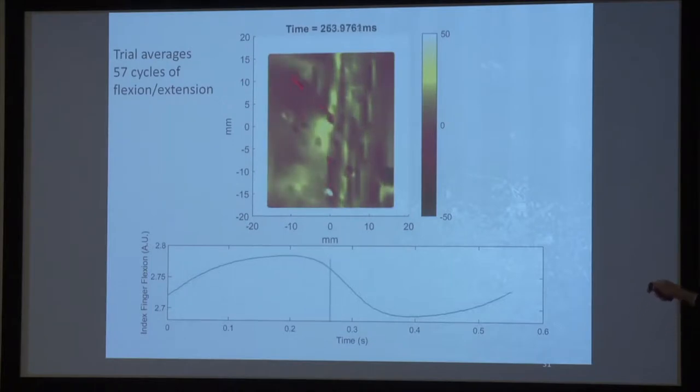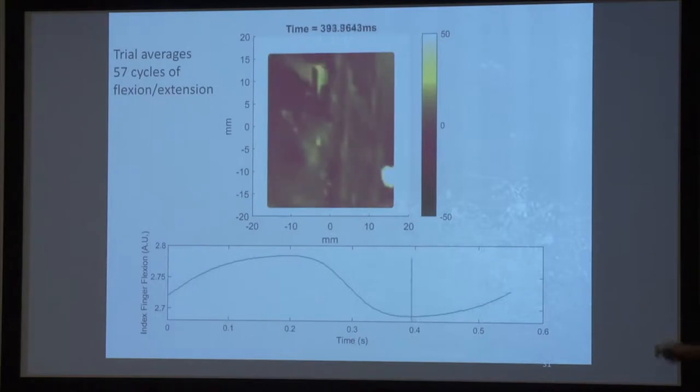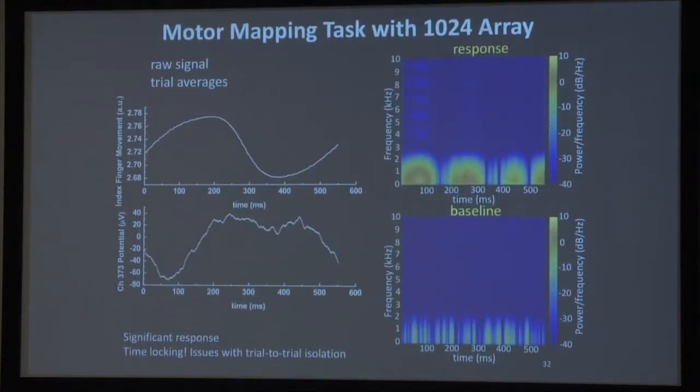Then we'll see that the yellow, higher potential also comes across the same path. And in a second, you will see once more that the high potentials appear when the potential is low on this side, and so on. This is a relatively new process, just from yesterday, and we're very excited about this result.